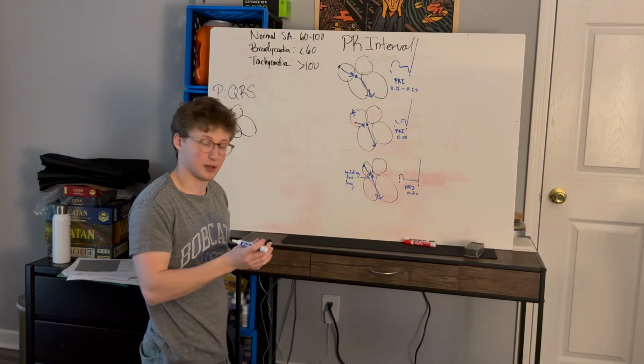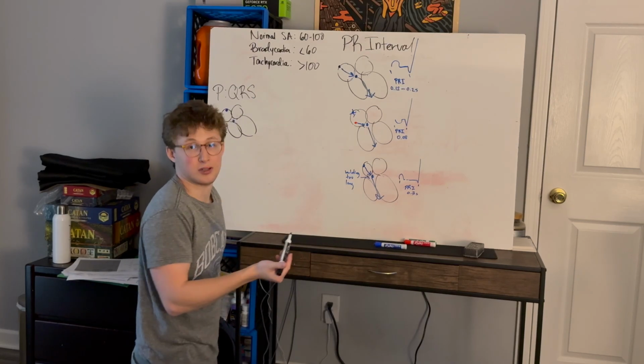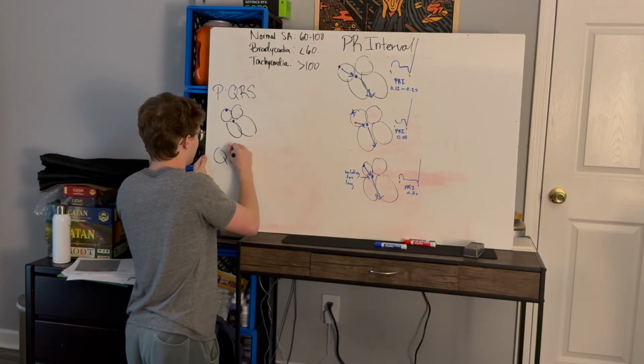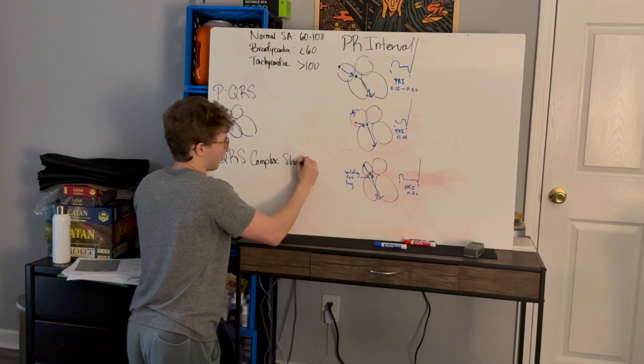Lastly, QRS complex. Arguably the most important one, especially because of what it usually means is happening. So QRS complex, shape is what we're looking at, shape, time, whatever you want to say.